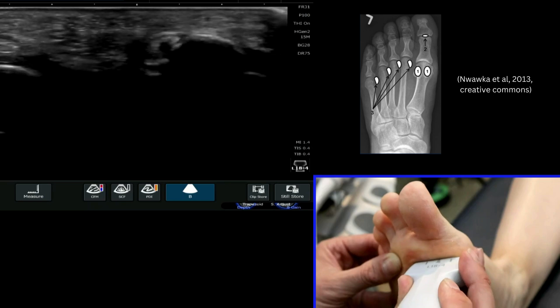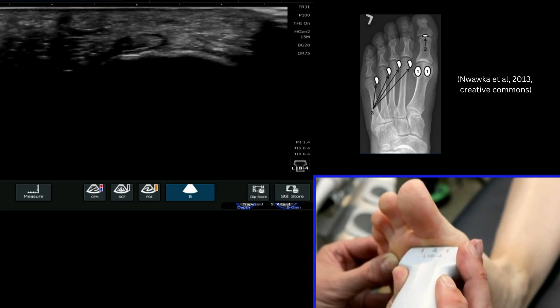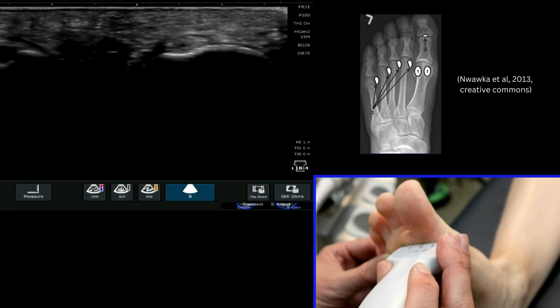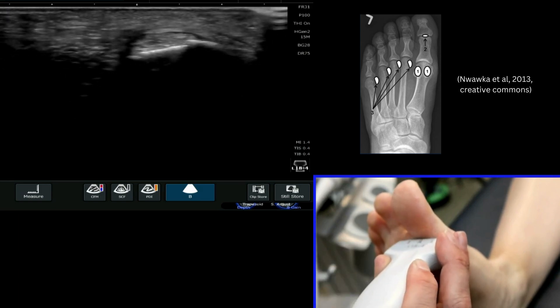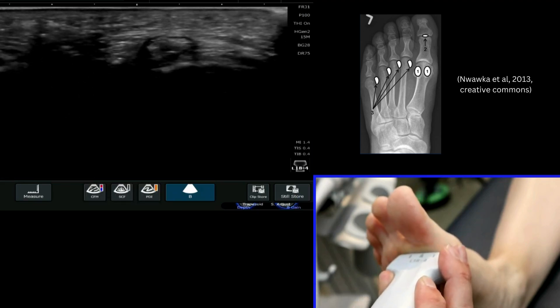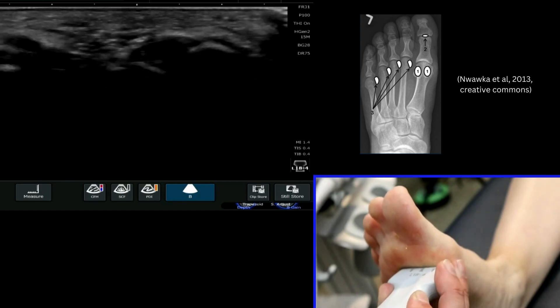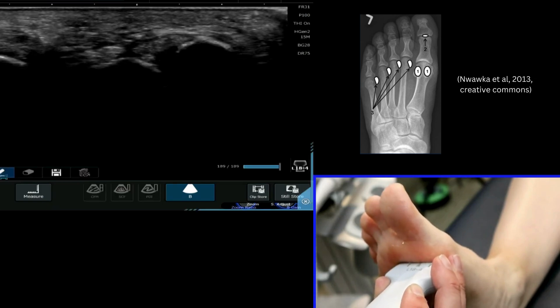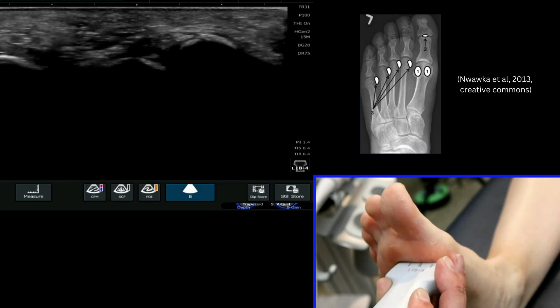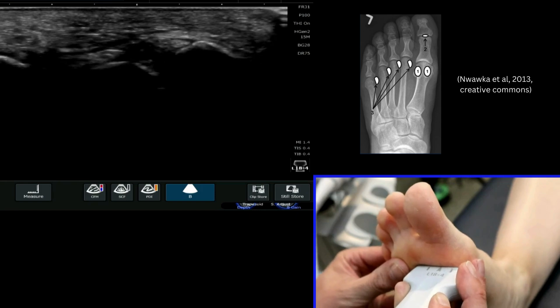As I start to move my probe up and down we can start to highlight the flexor tendon that comes down underneath the big toe — the flexor hallucis. We can see that very clearly here. As we come down underneath the joint itself we'll see two bones appear, which you can see here and here. These are your two sesamoids — your medial and lateral sesamoid that lie under the base of the first metatarsophalangeal joint.